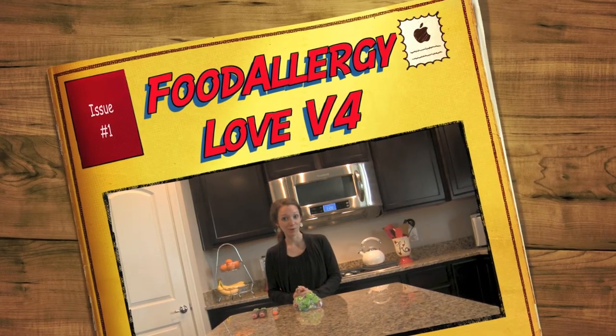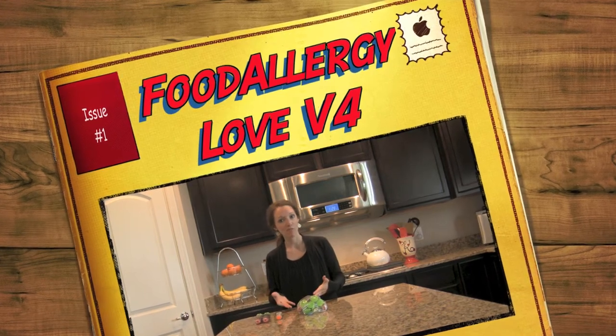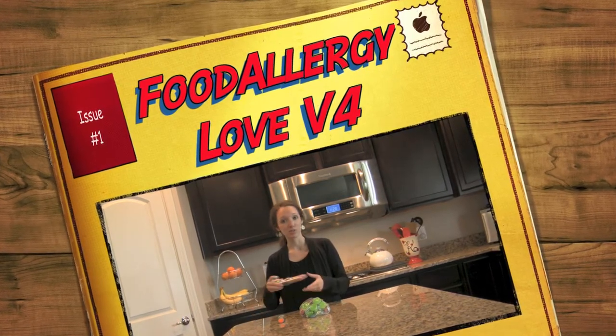Hi and welcome back to Food Allergy Love with Lauren. Today I'd like to talk to you about training not only yourself but others who care for your children in using and administering epinephrine.